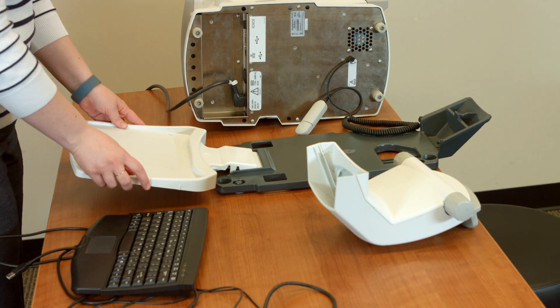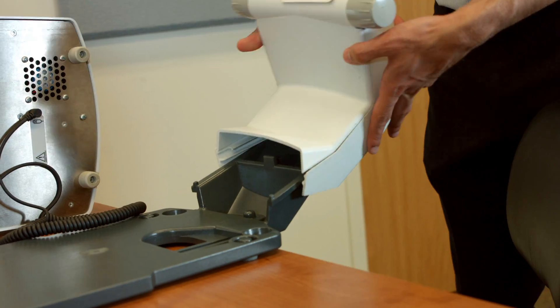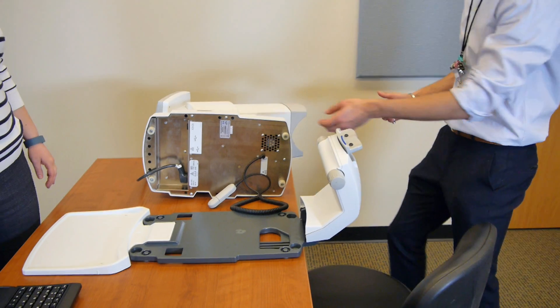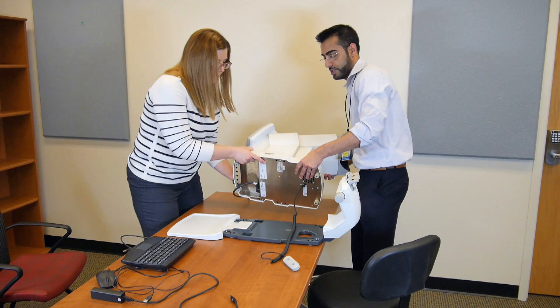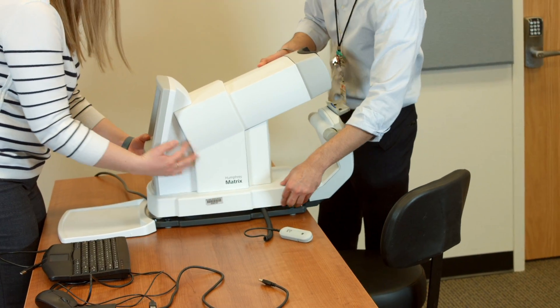Snap the keyboard tray gently into the dark gray base. Now it is time to assemble the chin rest with the keyboard tray, which will serve as the base of the instrument. Sweep the attached cord to the right side of the instrument, which is the side with the on-off switch. Then gently lift the instrument off of its side and place it carefully into the base.